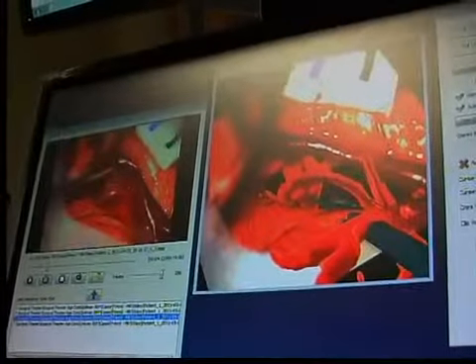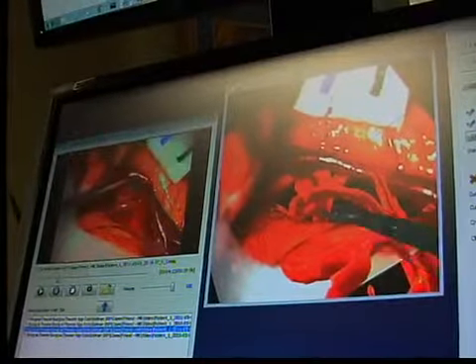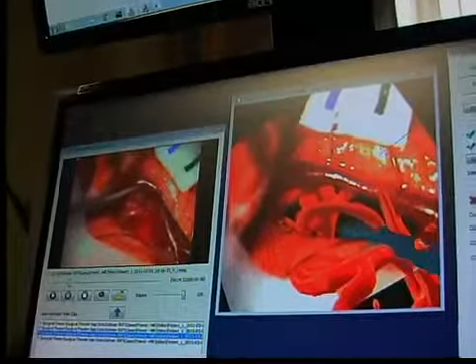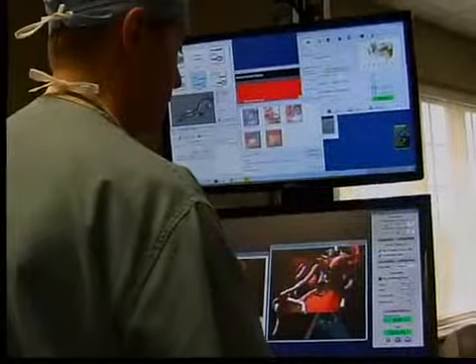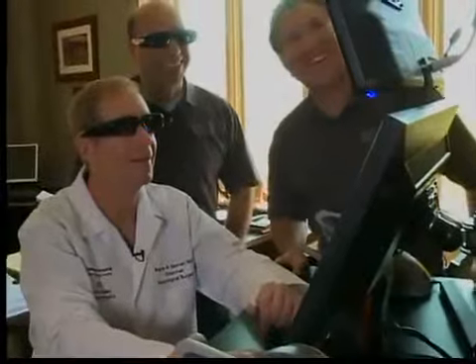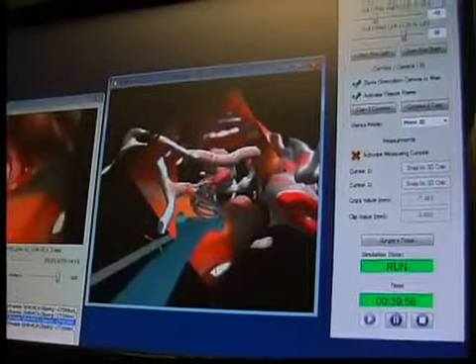Now I find myself in the situation where I can transform my knowledge, my experience, from war machines to saving life machines. Dr. Selman's demonstration shows us how it works using the patient's real CT or MRI scan. This robotic tool helps the surgeon mimic what he would be doing in surgery to perfect it. If I say, you know what, I didn't like that exactly, the advantage here is practice using it as many times as I want, whereas I could never do that at surgery without actually harming a patient. It's never been able to be done before in surgery.